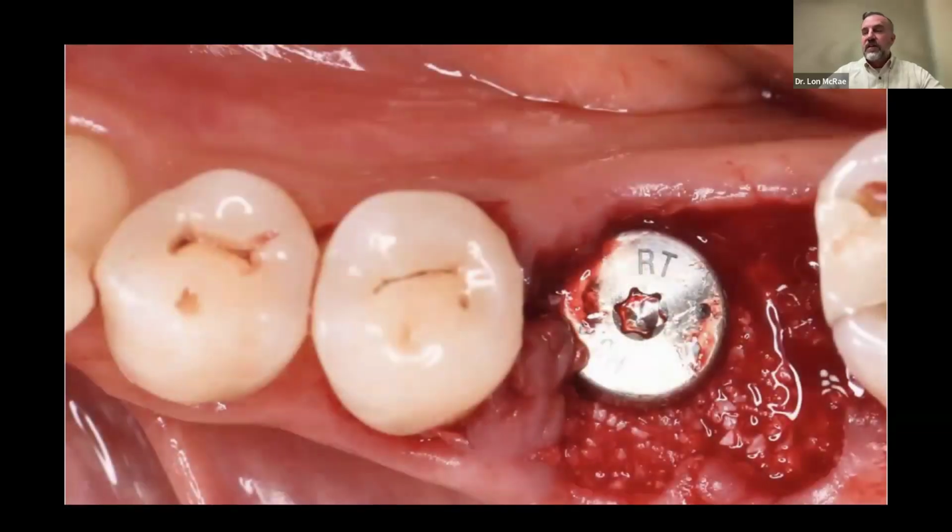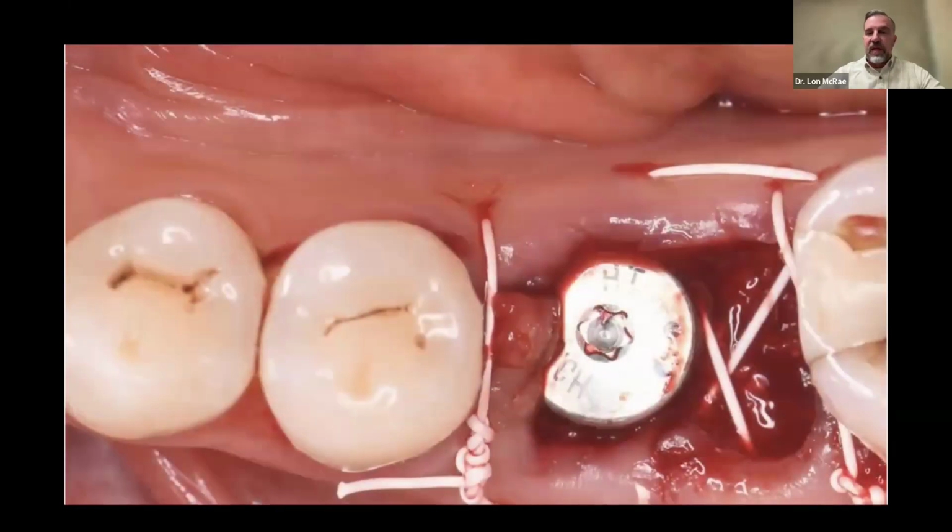Here is the abutment. So this is an immediate placement with an abutment. Again, even with the abutment, we have a big area that is not sealed at all. They did bone graft, which looks like a beautiful bone graft. Then here is the sutures. I think the suturing is very good. They bring the papilla together.